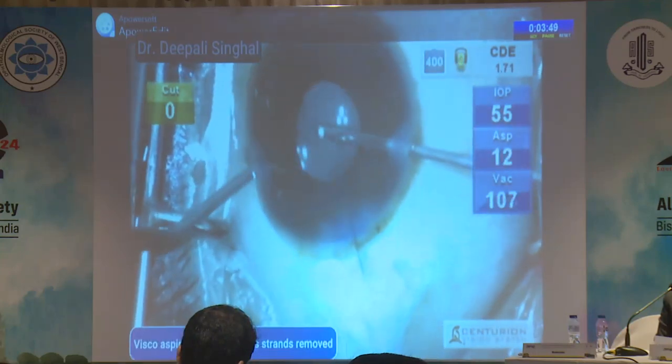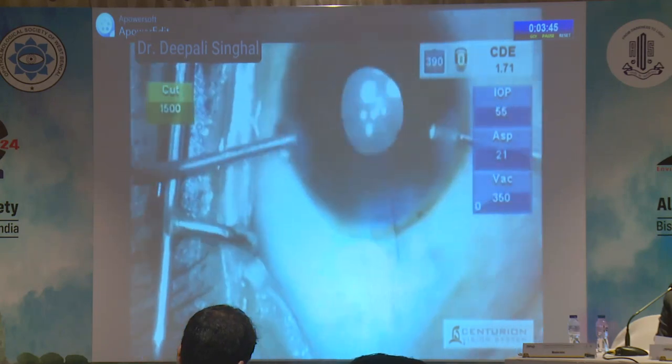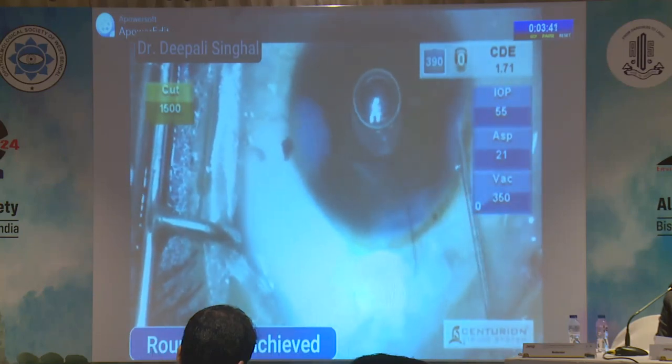Visco aspiration and anterior vitrectomy was completed. Air bubble was injected to make sure there is no vitreous in the AC, and a round pupil was achieved.